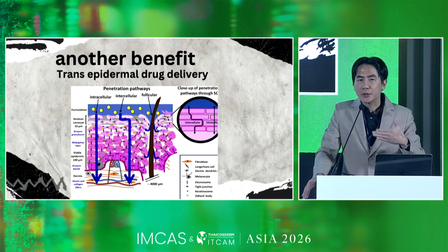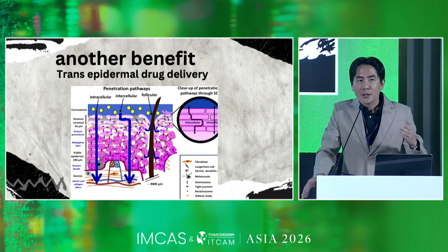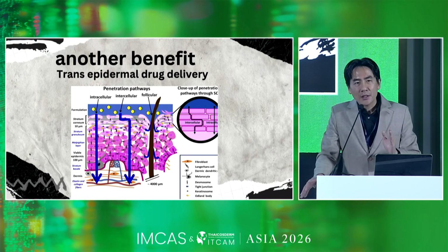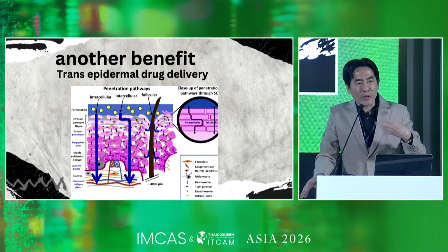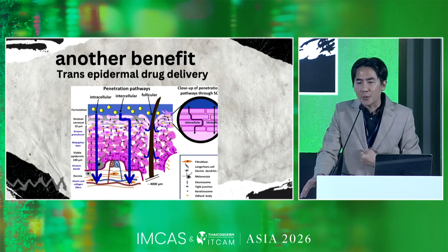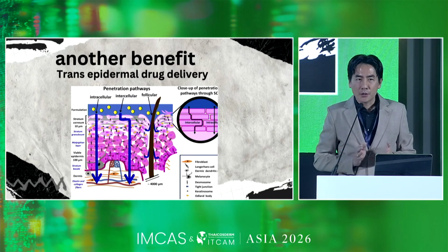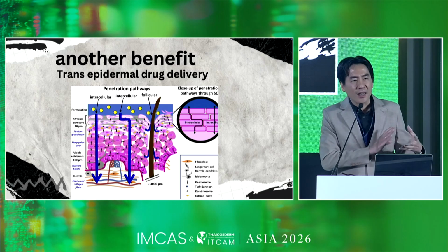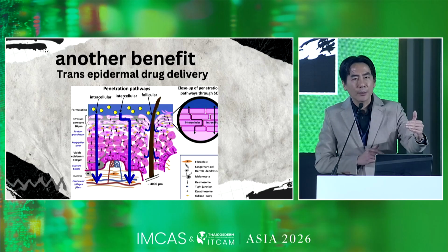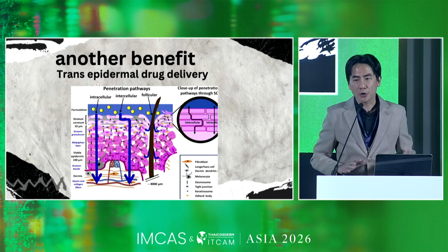penetrate the thulium laser into our skin, because it's slightly less sensitive to water, the pathway of the laser just creates a slight ablation in our skin. And then in the basal membrane, where our water is mostly, that's going to create the most ablation in our skin. So basically, it's going to create a teardrop shape. From the first pathway, it creates a slight ablation, and at the end of the pathway, it creates the ablation if we use it normally.